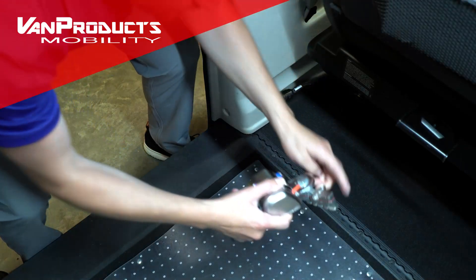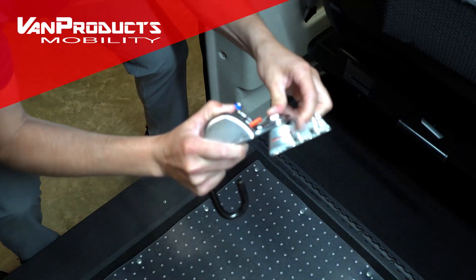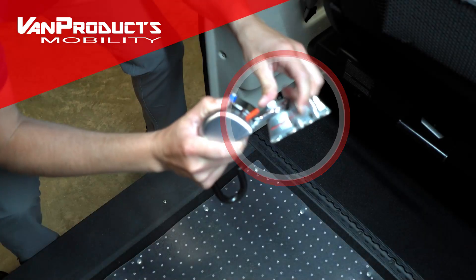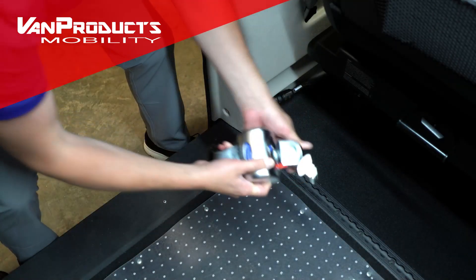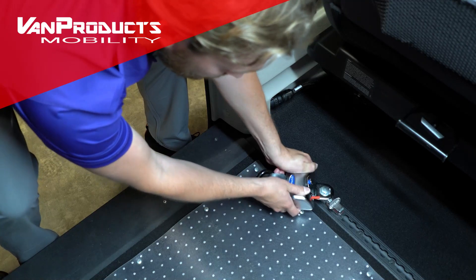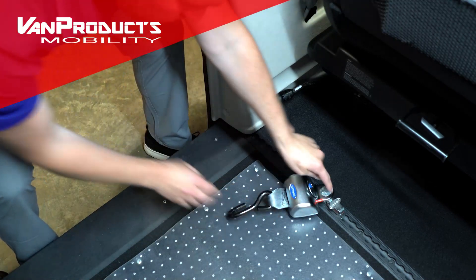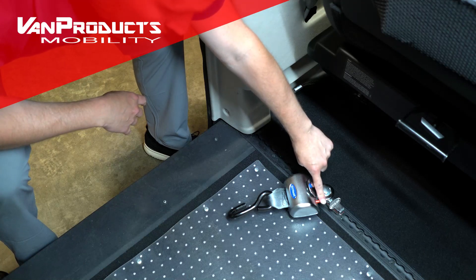These tie-downs are adjustable in the L-track floor fitting — they can be moved anywhere to accommodate power or manual wheelchairs. Make sure they are secure and tight in the floor before using.